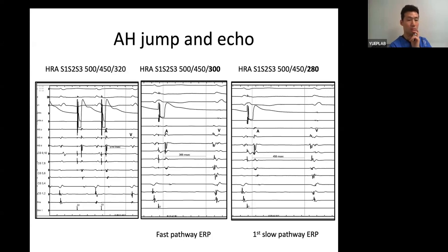Okay, that's the reason. So every time you have an echo, it has to have some degree of fusion between septal A and posterior activation A. When S2 gets shorter, you will see more pronounced CS activation than His bundle. Okay? You need to show that degree of eccentricity. In other words, anterior input versus posterior input, posterior becomes more markedly pronounced compared to anterior input. But always there's going to be some fusion.